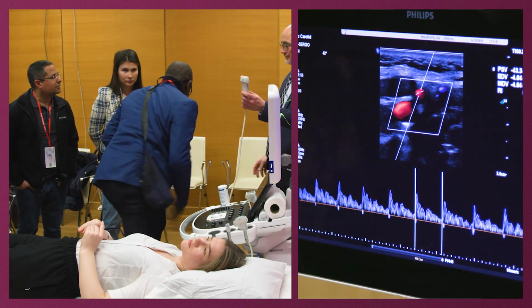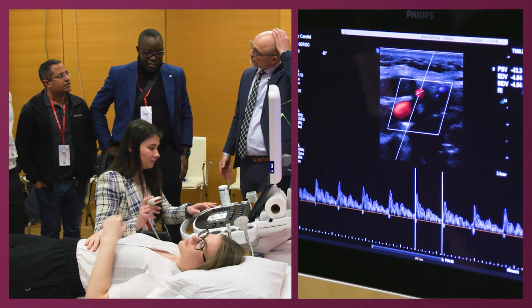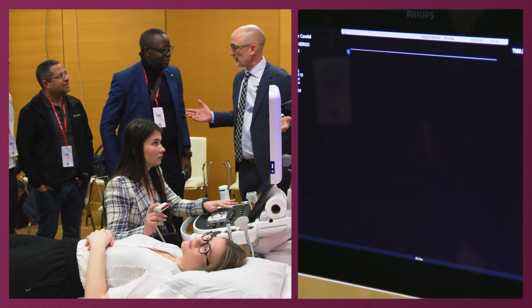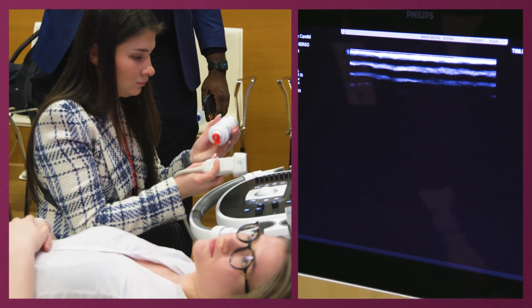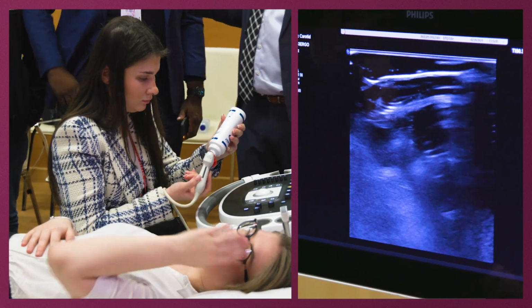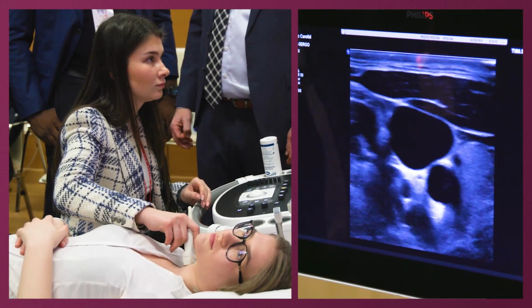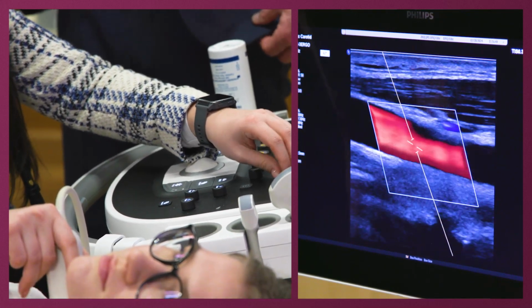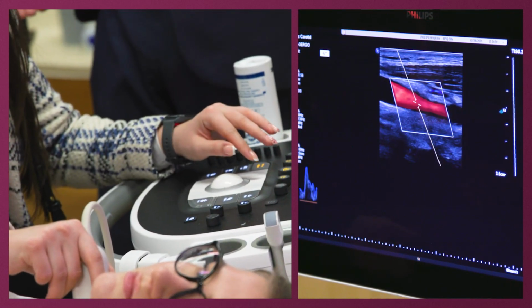Yes. Can you talk a little bit about vertebral arteries? Vertebral artery, there's a big fuss about that. I think it's funny to scan. I like to scan it, but I never use it, so we've stopped. Just like for steal syndrome. How many patients with that? I think I've seen 2. I think we've treated 2 in 30 years. So for a stroke patient, it doesn't make sense. You could look at the vertebral artery and see if the flow is running towards the brain or the wrong direction. But we have stopped because I don't think it has any consequences. We very seldom treat vertebral artery.